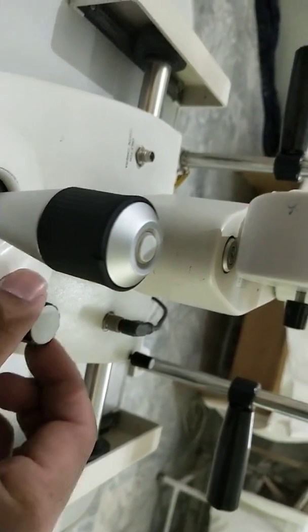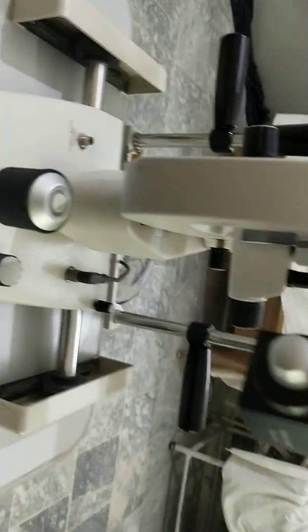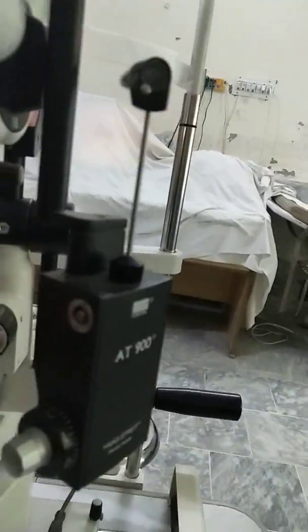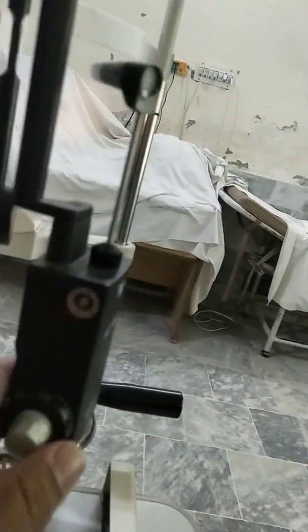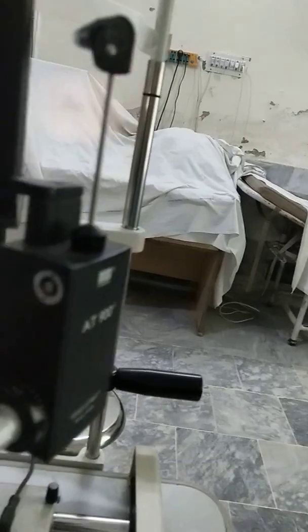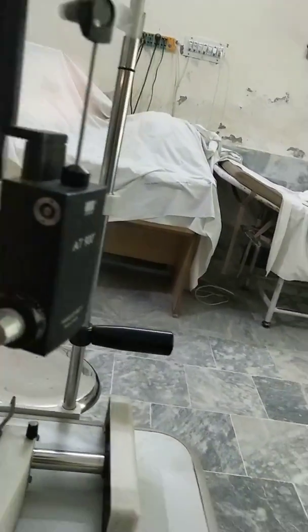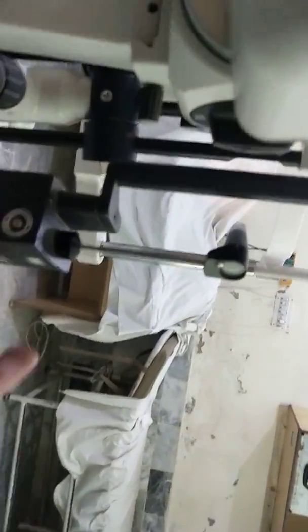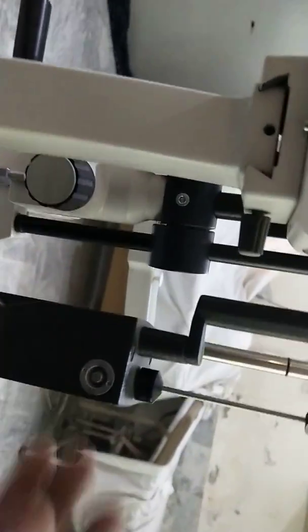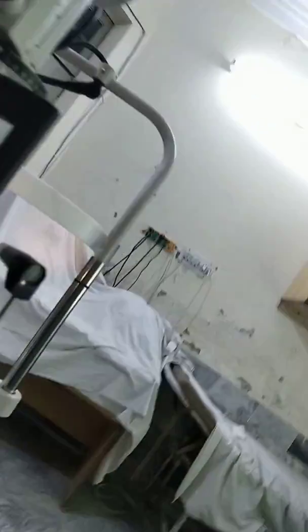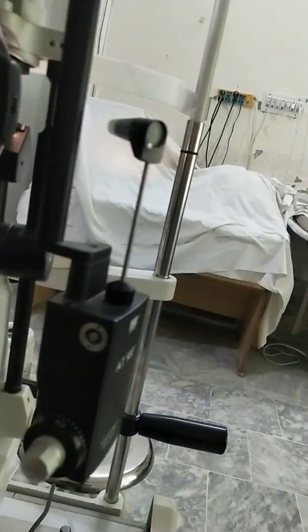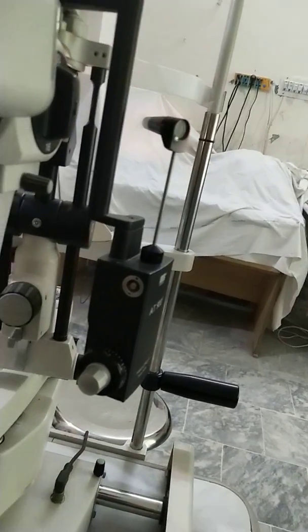And here that is the tonometer, Goldman applanation tonometer mounted on the slit lamp. So this is the Goldman tonometer. It is attached and with it we can take IOP, intraocular pressure.